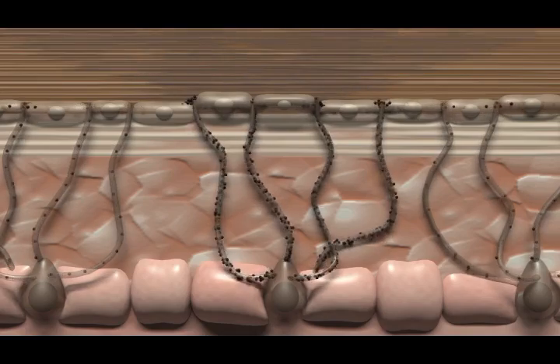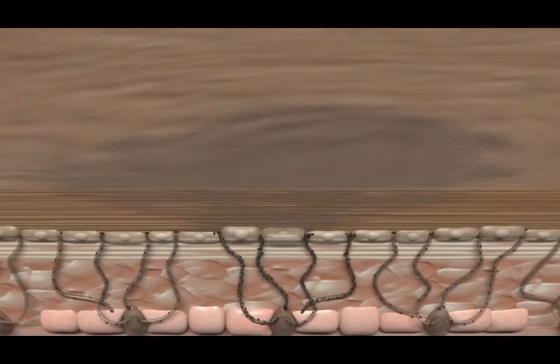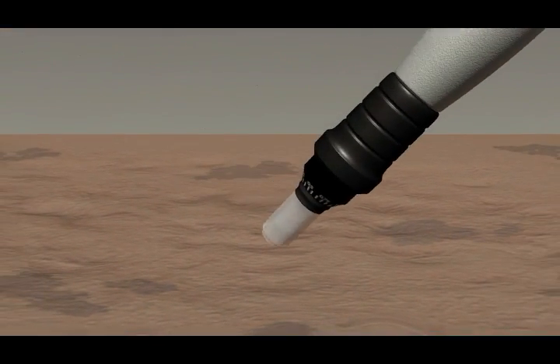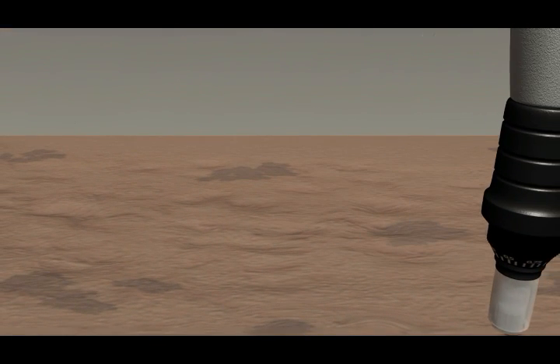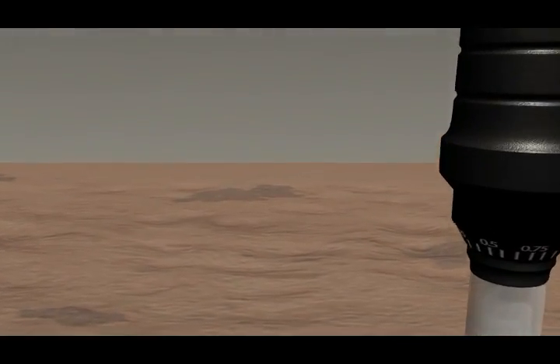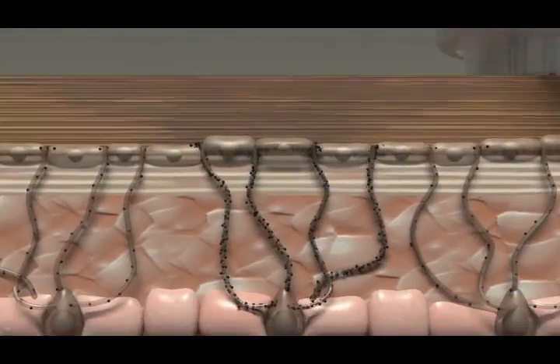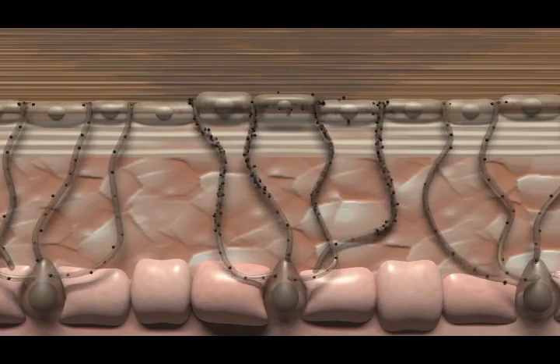Hyperpigmentation and dark spots can be difficult to treat, especially on darker skin. Upon penetration, the Milano Pen begins to safely deactivate the melanocytes and reduce melanin production. Our advanced fractional Milano Pen uses precise laser-like micro needles to cosmetically correct these blemishes.